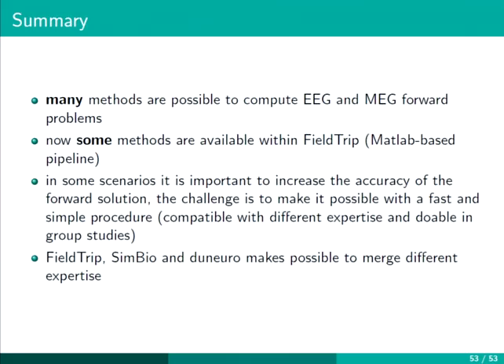My experience with co-registration is that especially the front part is not so problematic, because finding a point at the nose is easy. In the MRI, it's also quite clear. But at the ears, of course, I think they can easily be messy.